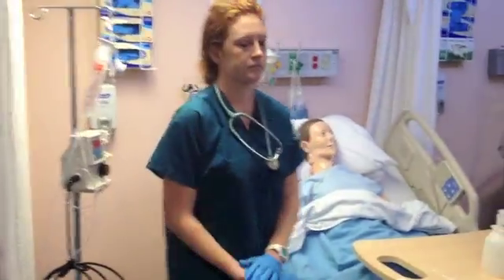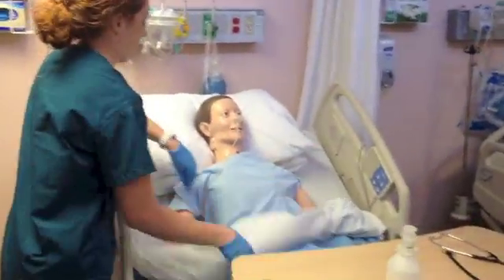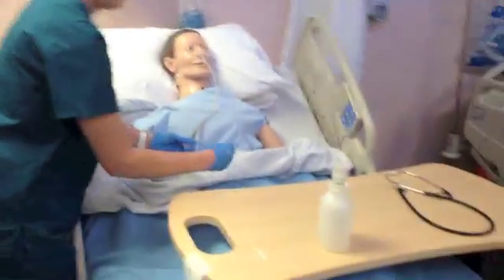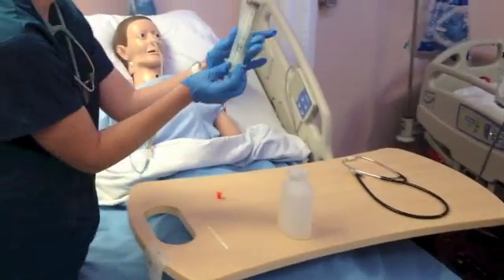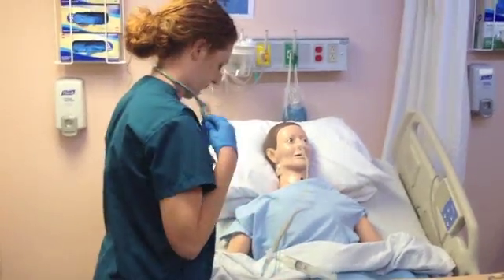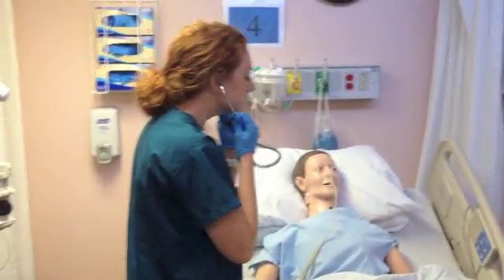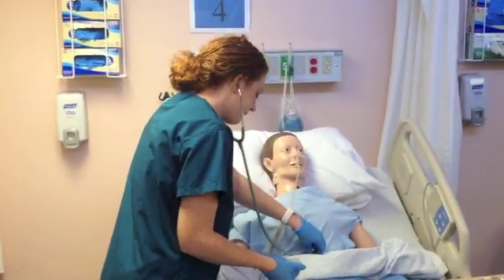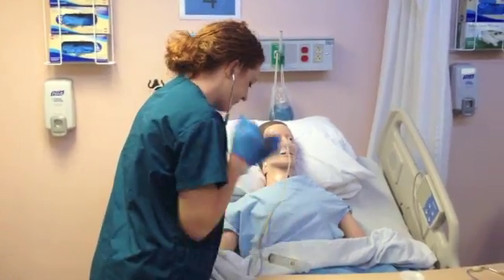Next, we're going to verify the placement of our NG tube. We're going to do this by drawing up first 30 milliliters of air to inject into the tube. While she does this, Kelly's going to auscultate for an audible pop, which will tell us that we're in the right place. All right, we hear some noises, so we're in the right place.